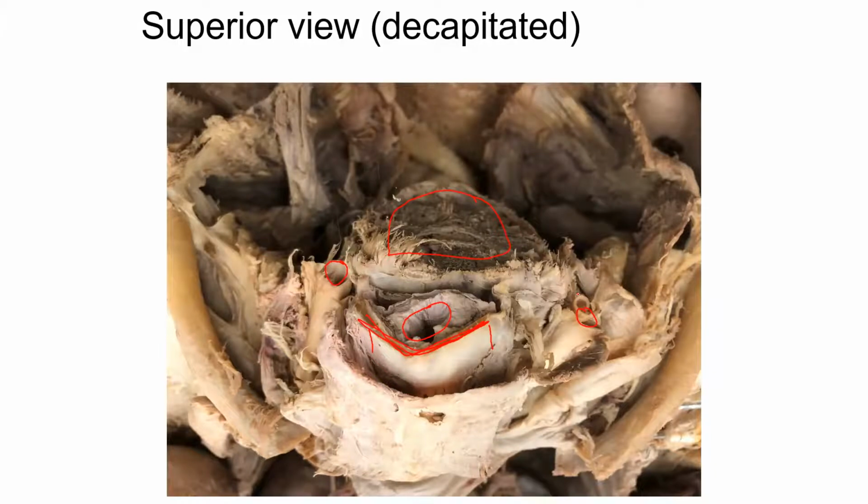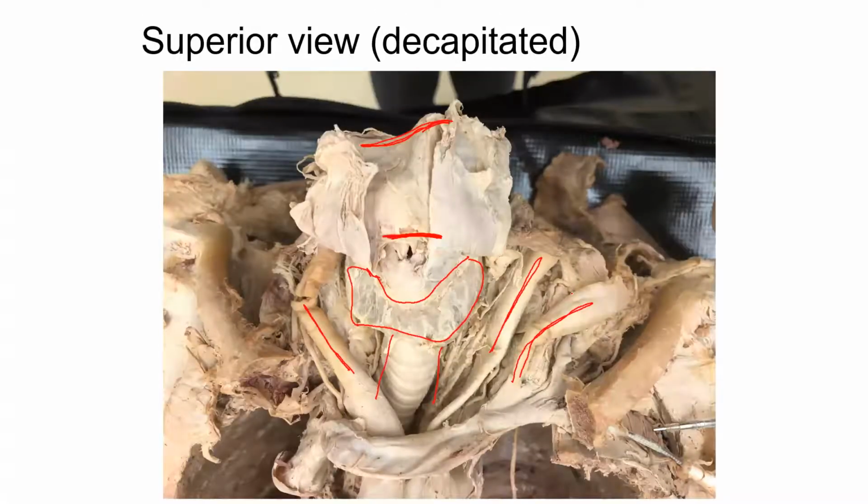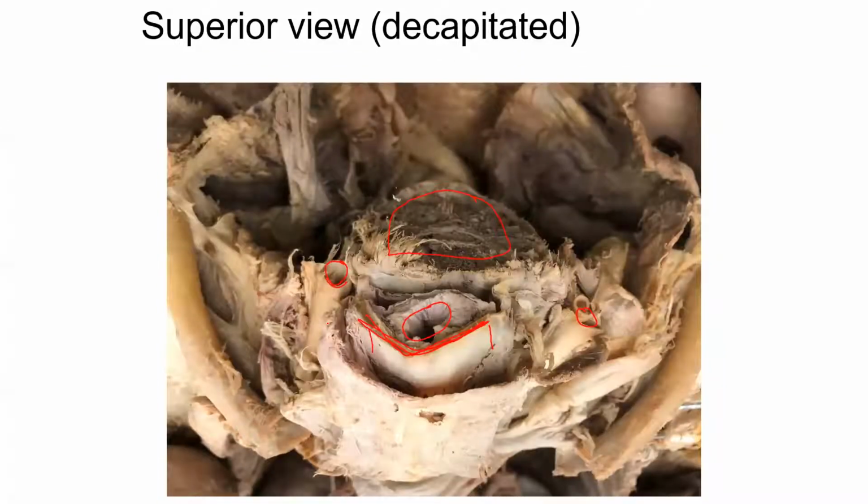So you can see that nice stiff wall, which really indicates this is an artery as compared to that thinner wall, such as this, which is a venous structure. This is a venous structure as well, that thinner wall, whereas this is a much more turgid or patent artery there.